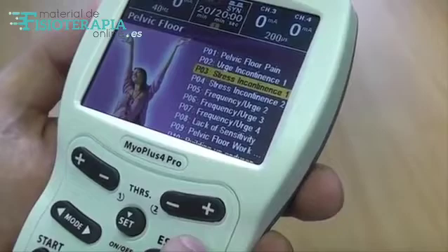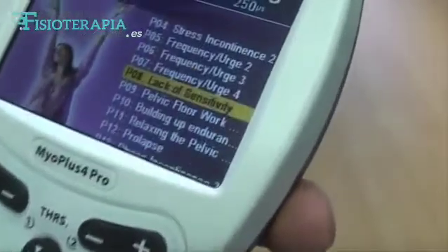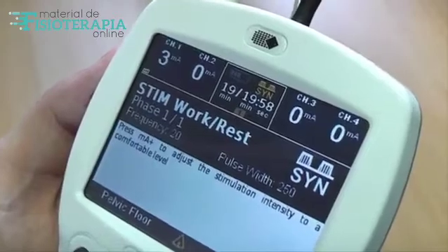Now press the Program button to select one of the preset programs, for example Stress Incontinence, Frequency and Urge Incontinence, or Lack of Sensitivity. After you have selected your preferred program, you can then start the program by pressing the MA Plus button until you get a comfortable contraction.